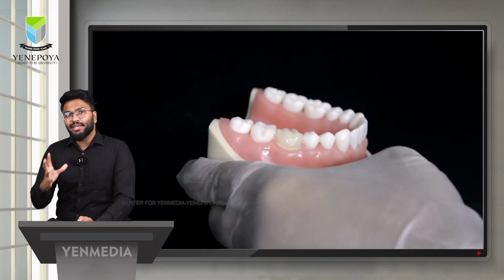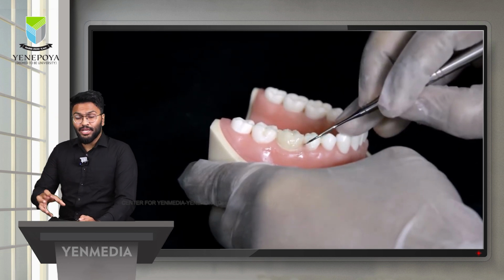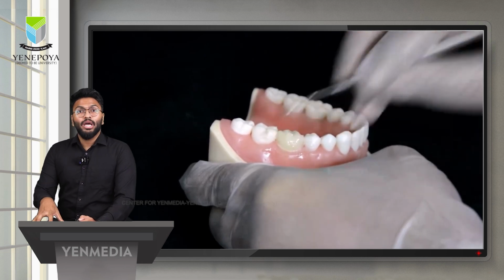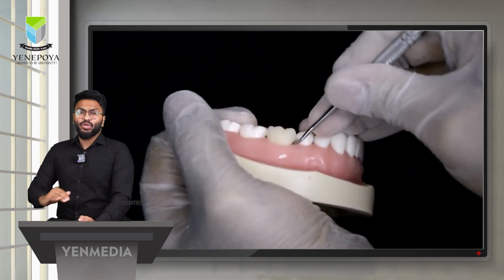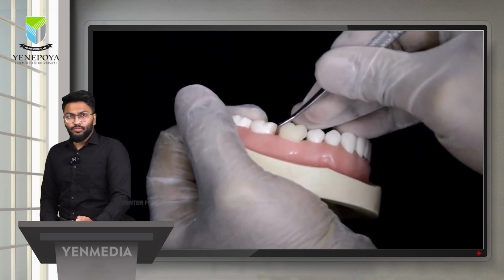Why? Because it takes at least 5 minutes to completely set. There can be some kind of dimensional changes if it comes along with the putty. So it is always important that you keep the restoration on the tooth itself. After around 5 minutes, you can take it out.